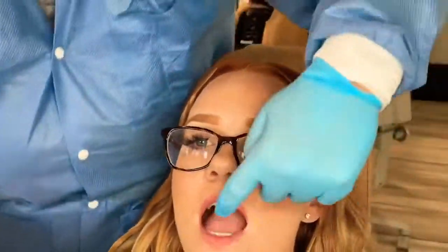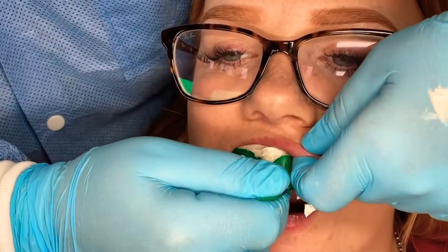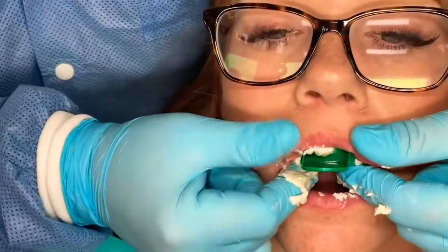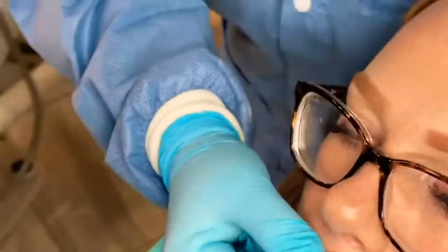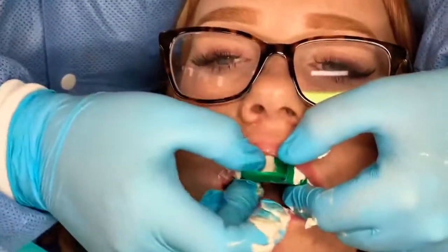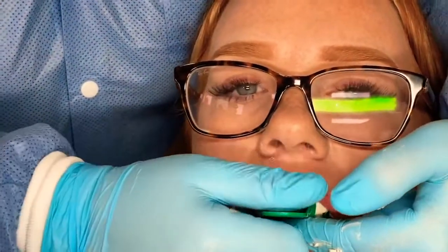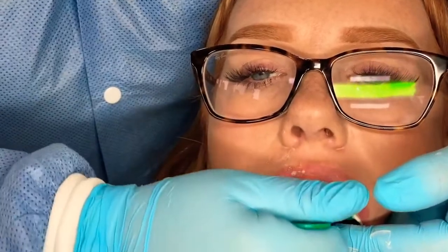Coming from behind her, I'm going to retract her cheek and go in. I'll line it up in the middle, all the way up, and wrap her lip around it. We're positioned behind her so that if the patient started to choke or gag, we could take our arms and lean her forward. I'm going to slightly rub down on her lip to get that muscle trimming — that lip roll. Breathe through your nose. I lined it up for the midline straight down — there's a little groove in the front and we want to make sure it's aligned with the midline so we're straight. I'm going to take my fingernail and see if I can push it into the alginate — it seems like it's already set up. It's a fast-set alginate. I'm going to put my finger on her lower teeth so when I take this out, I don't hit her.